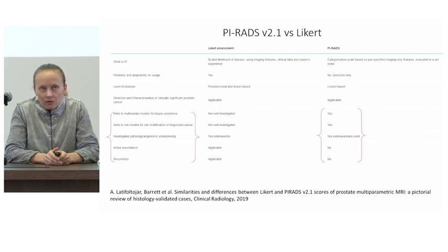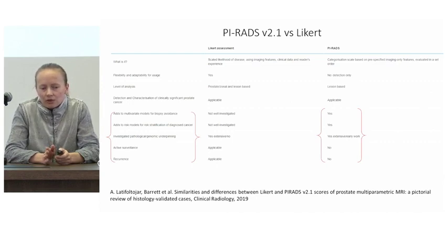Of course, for now, we have a proposed grading system for recurrence, like PI-RR, and I'm happy with that. So just raise a question to yourself: what are you working with? And for urologists also keep in mind, PI-RADS is a tool for communication, but it's not as objective as people think it should be.